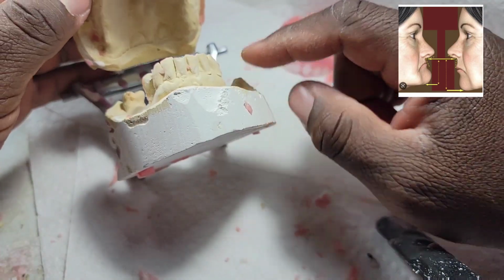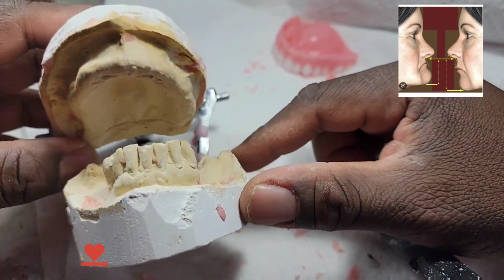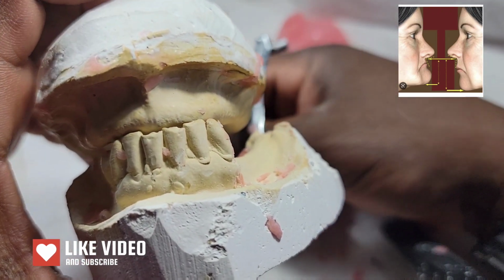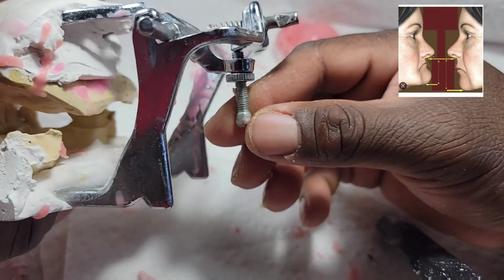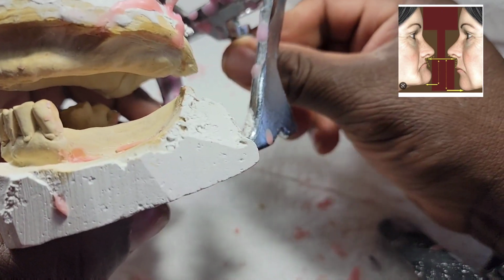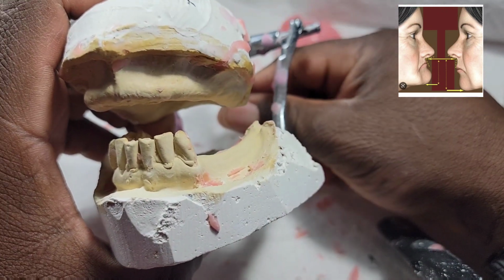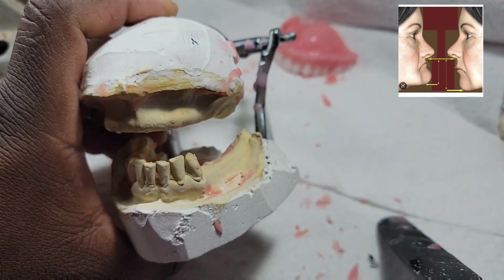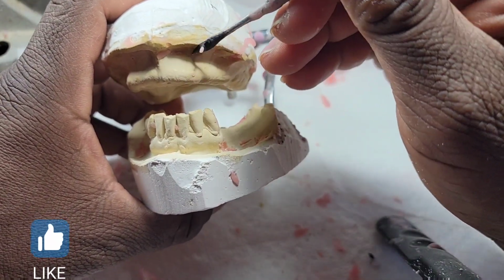So when you lose your teeth, you lose the sense of where to bite. There are no teeth right there, so you basically collapse. That's why the articulator has this screw back here, so you can open it up and adjust. Back in the day I would use a ruler to measure this distance for me, which is normally 32 millimeters from here to here.